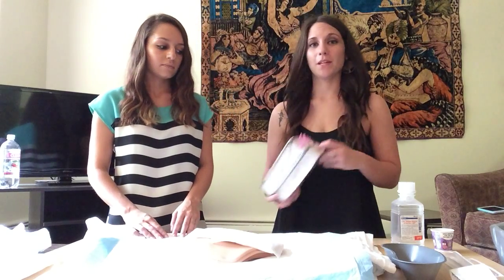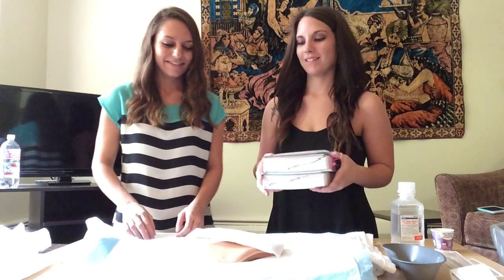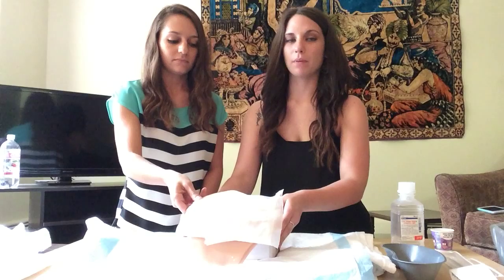We are going to position the patient using our drug guidebooks. We're going to position the patient on their side, propped up by the books.